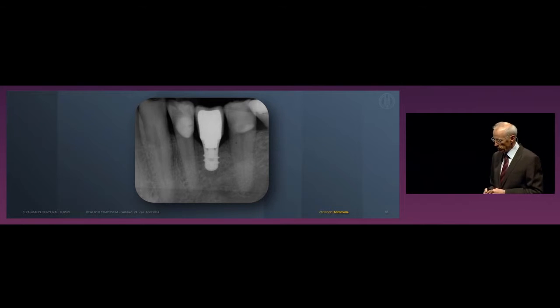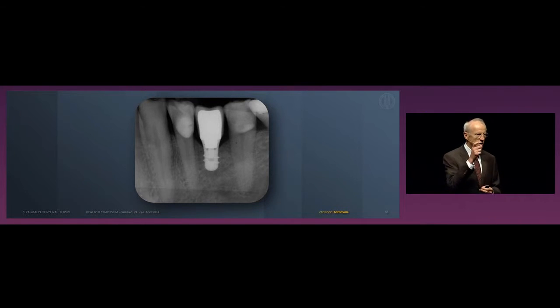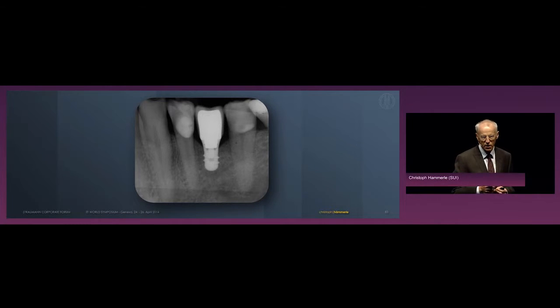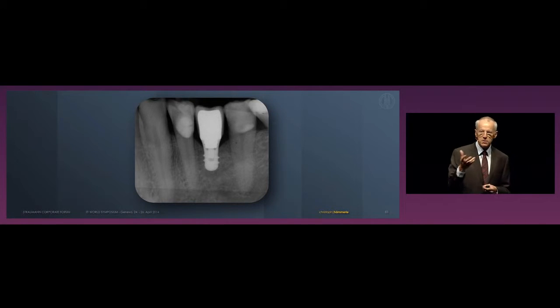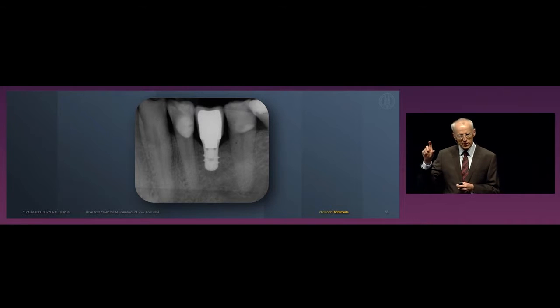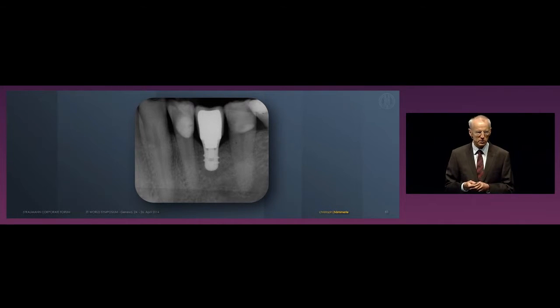Then maybe you also say, well, there's more bone available, so you should use a longer implant. So I will ask you, there are situations, here for instance, you could easily place an implant of 10 millimeters. But what if you have a clinical situation where you have 30 millimeters of bone? Somewhere anterior mandible, situations like this occur clinically. Will you then place a 30 millimeter implant? I imagine not. They're very hard to buy. So the critical element is not how much bone is available. So our thinking evolves around something different.